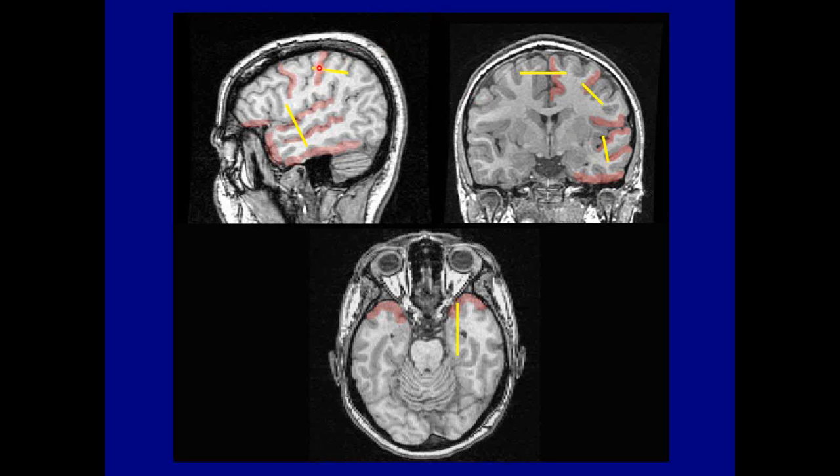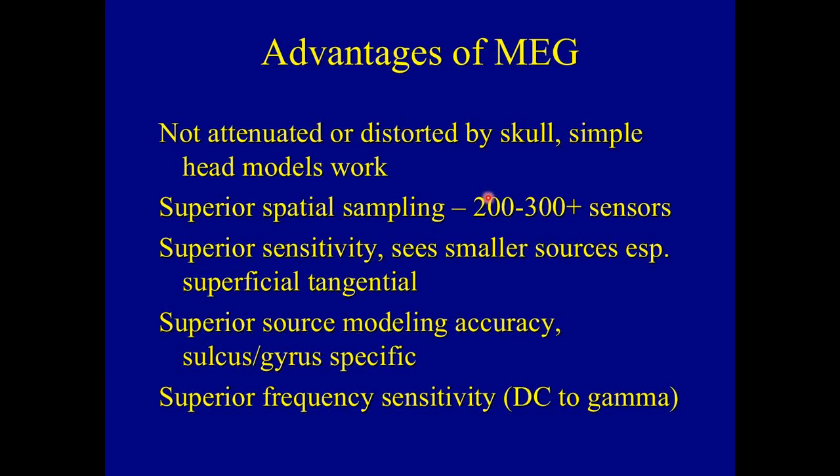So the MEG brain, now all of a sudden we see the sulci and fissures, but notice that the MEG is sensitive to cortex that produces tangential fields. Again, we have interhemispheric fissure. We have one side of very deep sulci. We have deep fissures as long as just one side is active, and certain planes like the temporal tip or the base of the cortex, etc., they're oriented such that they also produce tangential fields. Notice that the crowns of these gyri are not a source that MEG can see.